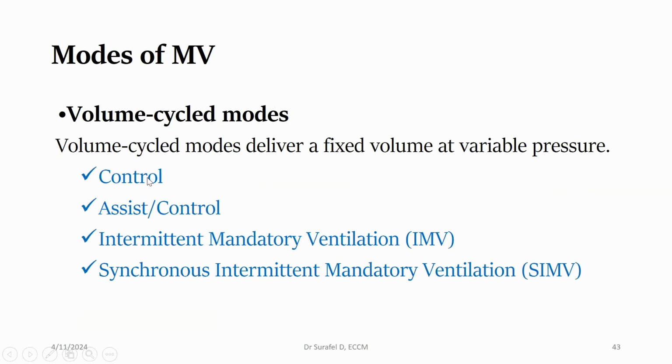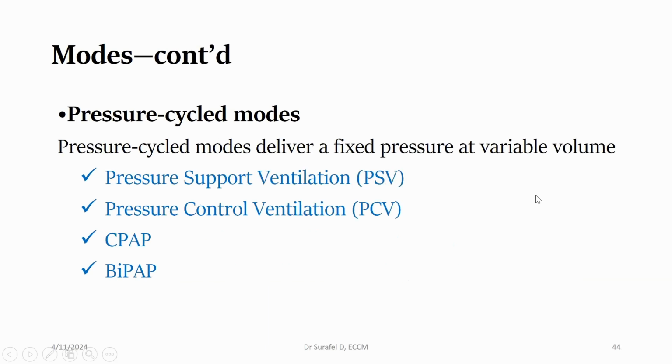The controlled mechanical ventilation is usually used for those patients who are deeply sedated, especially for general anesthetic purposes, especially for surgical operations, okay? Especially used in the OR units, controlled mandatory ventilation. For ICU settings, the most commonly used are AC volume control, or synchronized intermittent mandatory ventilation, volume control. So AC VCV, or SIMV VCV. Okay, is that clear? So these are the commonly used.